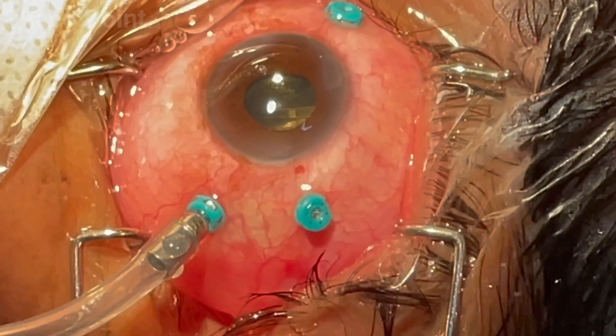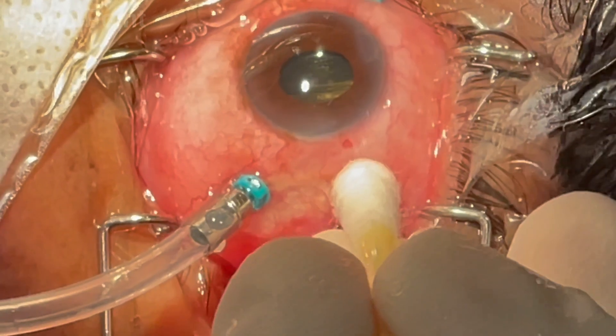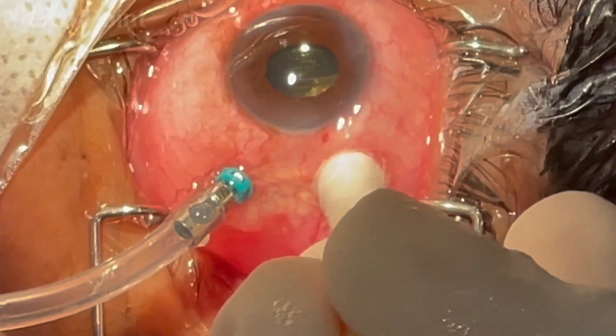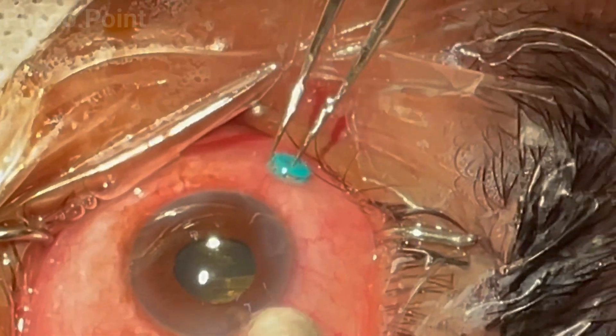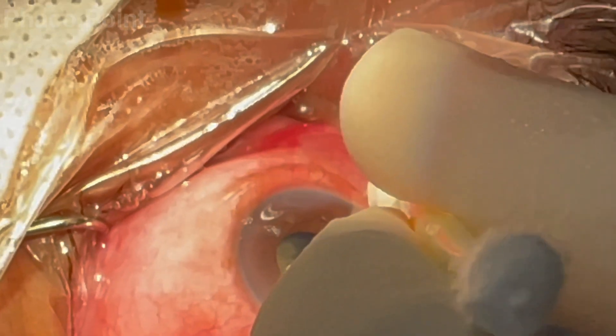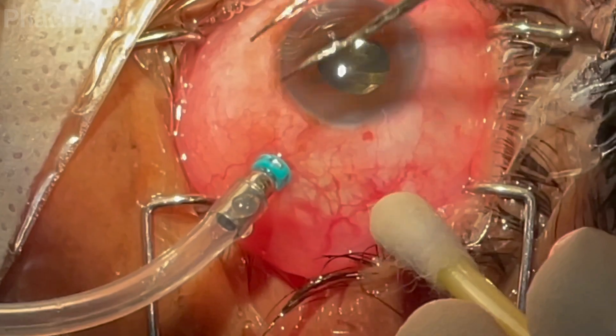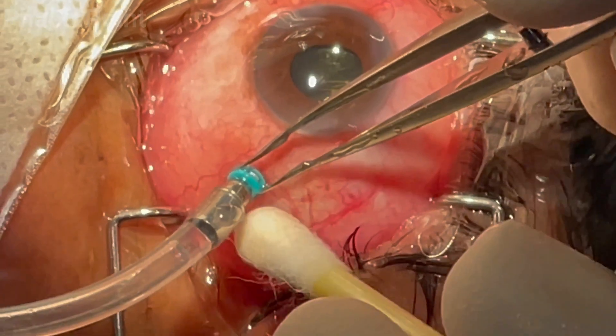Let us now understand the technique for removal of the three ports at the end of surgery. The infusion cannula is the first in and the last out. The superior temporal port is removed first, followed by localized pressure with a cotton bud. Next, the other superior port is removed with limb's forceps, again followed by pressure with the cotton bud. Finally, the infusion port is removed: the surgeon firmly grasps the cannula, pulls it out, and applies pressure.